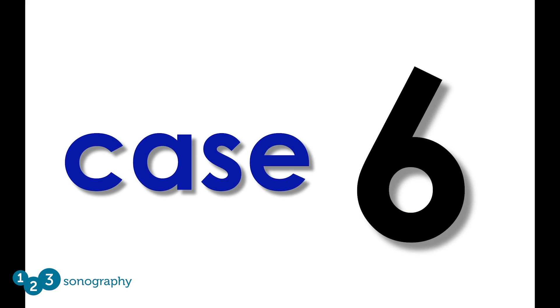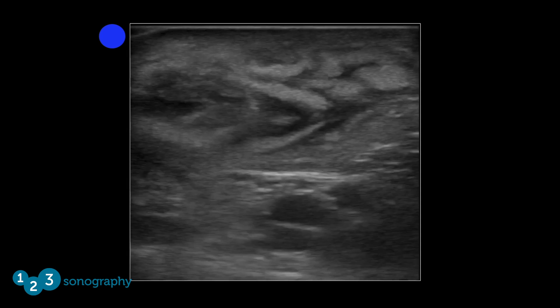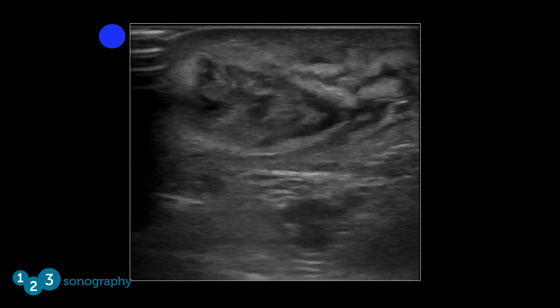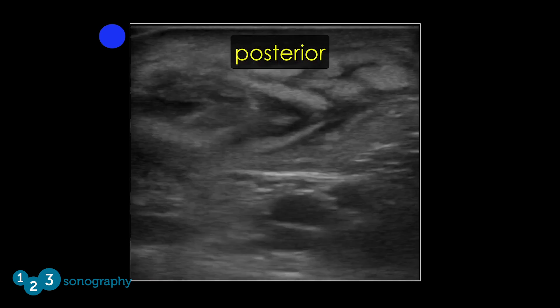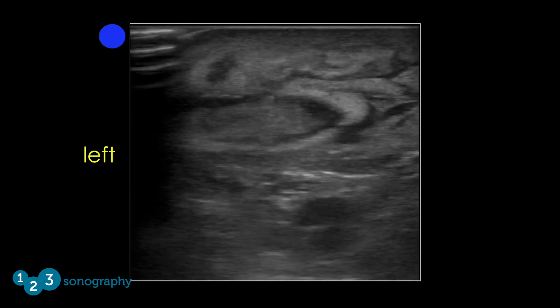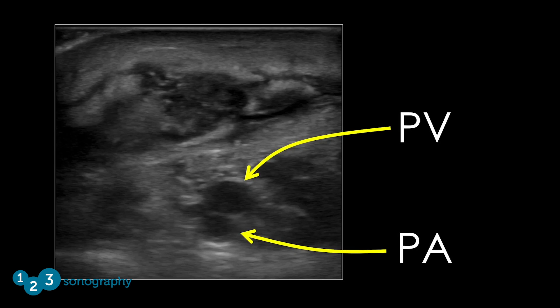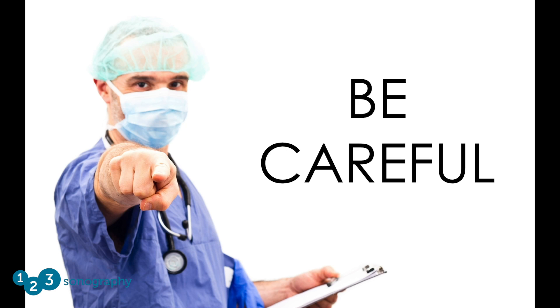Case number six: a 45-year-old female with increasing pain and swelling in her popliteal fossa. Her past medical history is remarkable for COPD, and she is currently taking oral steroids for a recent exacerbation. An axial view through the mass in the popliteal fossa — with the transducer on the posterior surface of the knee, the top of the screen is posterior and the orientation marker is directed to the patient's left. The examination reveals a complex mass consistent with an abscess. The popliteal artery and vein can be seen at the bottom of the image. Be careful about draining this abscess.